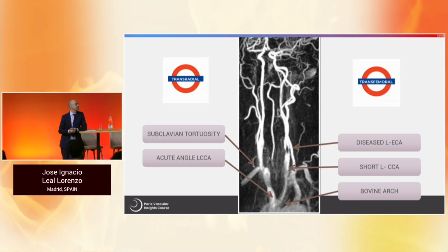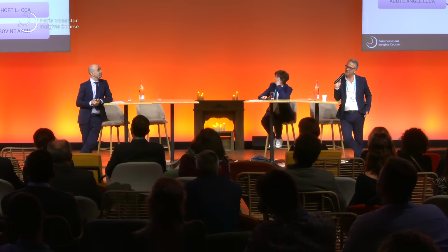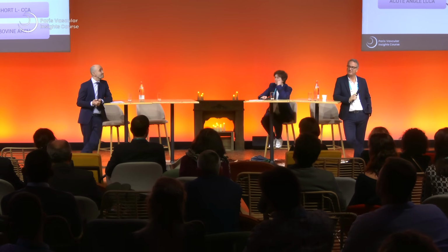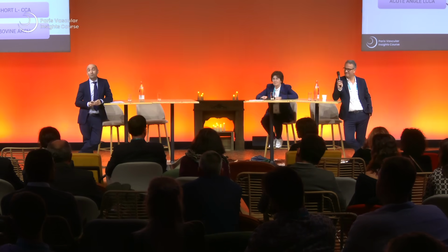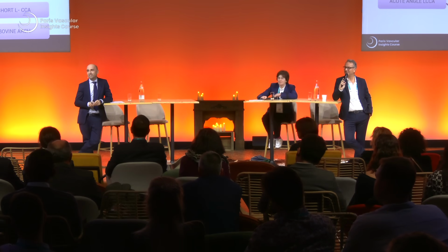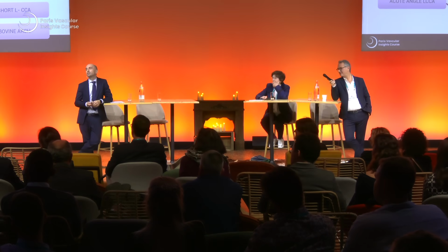Let's do it. First, TCAR. Do you think TCAR is a good option or not? Should we ask the audience? Of course. TCAR is a good option. It's a very low bifurcation indeed, and I told you the requirement is at least 5 centimeters from the clavicle to the bifurcation. It's a low bifurcation.